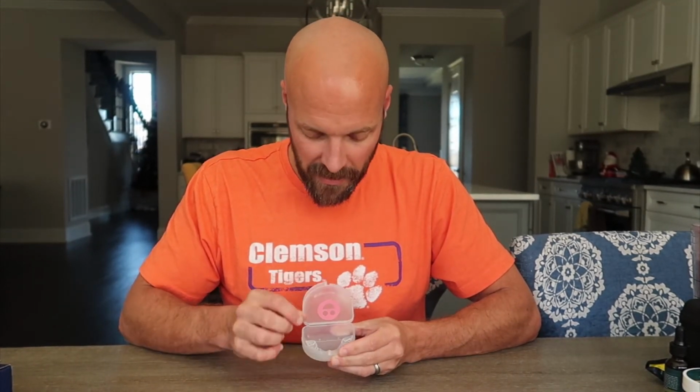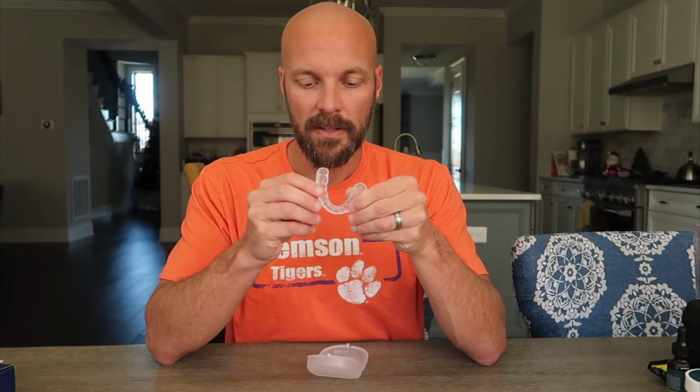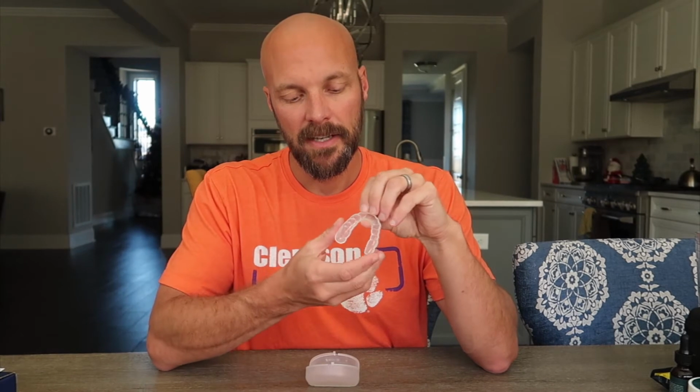And then your Nightguard is in there. This is made of, it's like a soft Nightguard. So it's not a super rigid hard one, right? So it bends. This is just an upper. You can get uppers and lowers. You can get a combination of whatever. And at the end of it, look, if you think of it as a retainer, like if you had braces, this is what a retainer would be like, right? Except a retainer is hard because it wants to keep your teeth in place. This is soft. And the idea is just, you know, people grind their teeth at night, and because of that, you can get issues where it can affect your gums, it affects your teeth. So this will prevent that because the rubber between your teeth will actually pad it and you won't grind your teeth down. So it fits perfect.